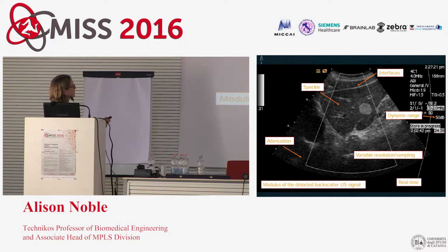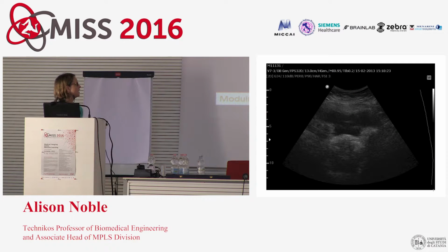And the other thing is that ultrasound attenuates with depth. So lower down, you're going to have a smaller signal relative to further up if you pass through the same tissue. So those are the factors that make ultrasound images different. They're always there, so they're predictable. And so again, if we're trying to build solutions, we should factor in that there is knowledge here that will always be repeatable.